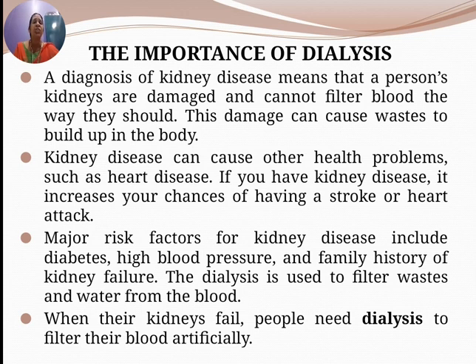Dialysis is used to filter out waste and water from the blood. When their kidneys fail, people need to filter their blood artificially, so a dialysis process is utilized to filter the blood artificially.